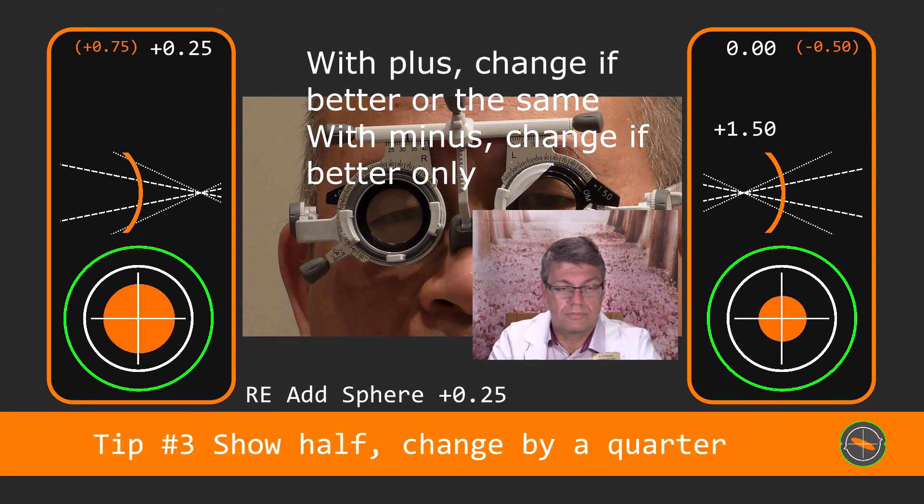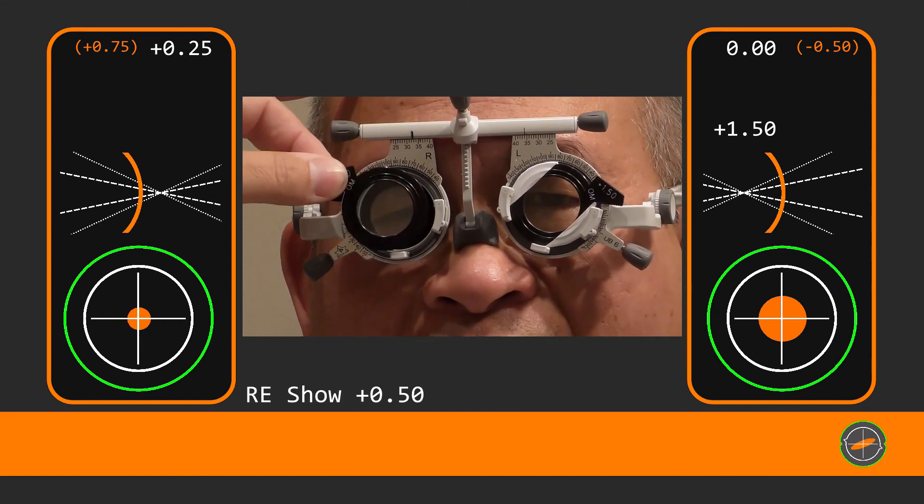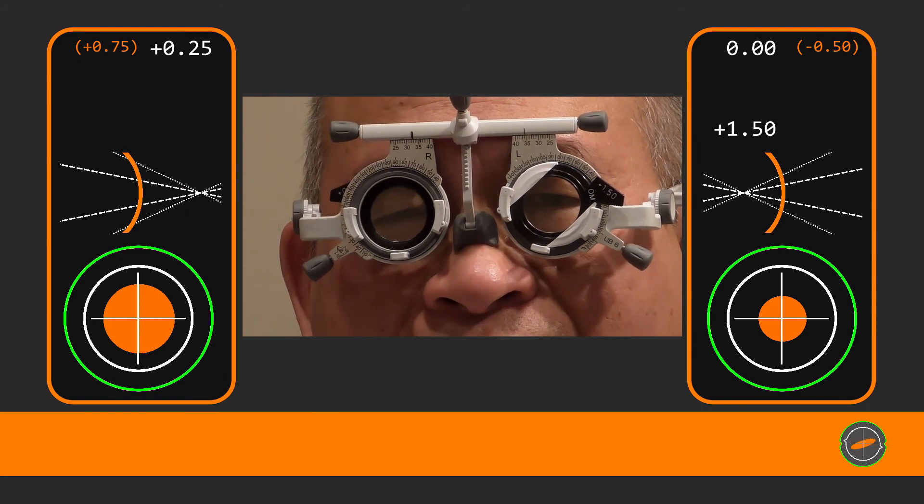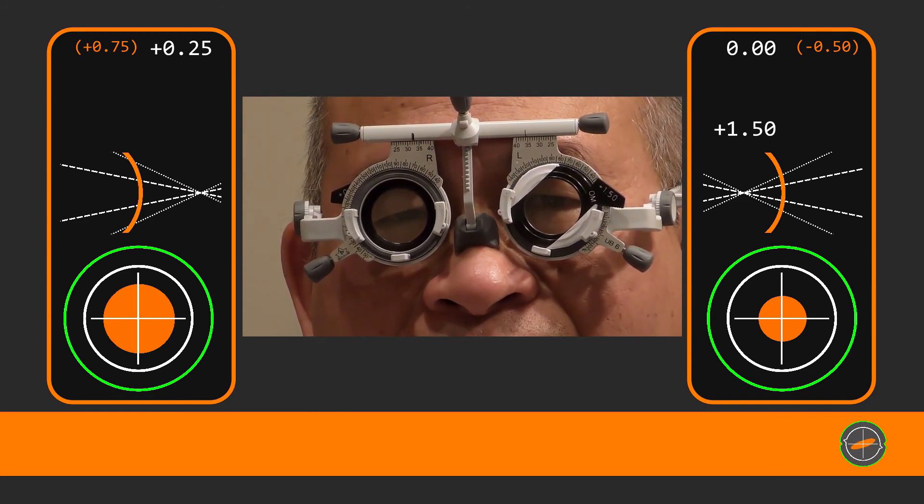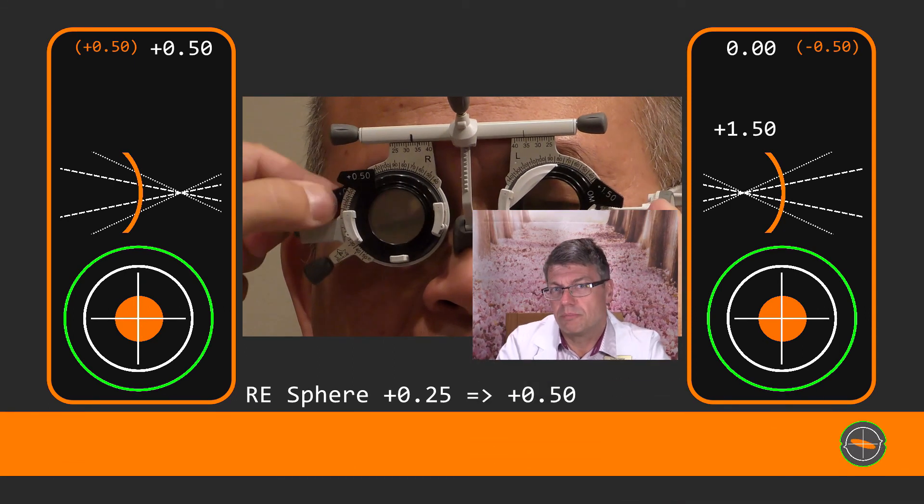Let's continue. And keep looking at it. Better with this one or without. Better with.